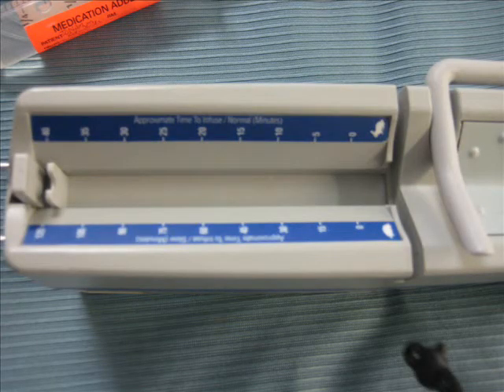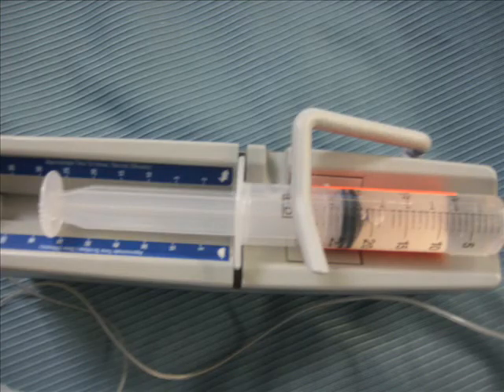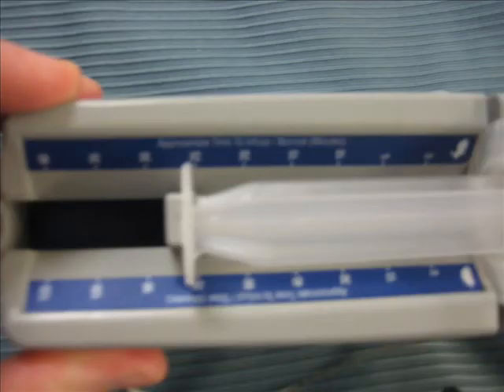Here you will see the slider is pushed up to the end because we are placing our medication into the syringe pump. Be sure that the slider is at the end of the syringe so that it can push the fluids out — the slider is the one that is doing the pushing. Be sure to have it positioned as shown here.